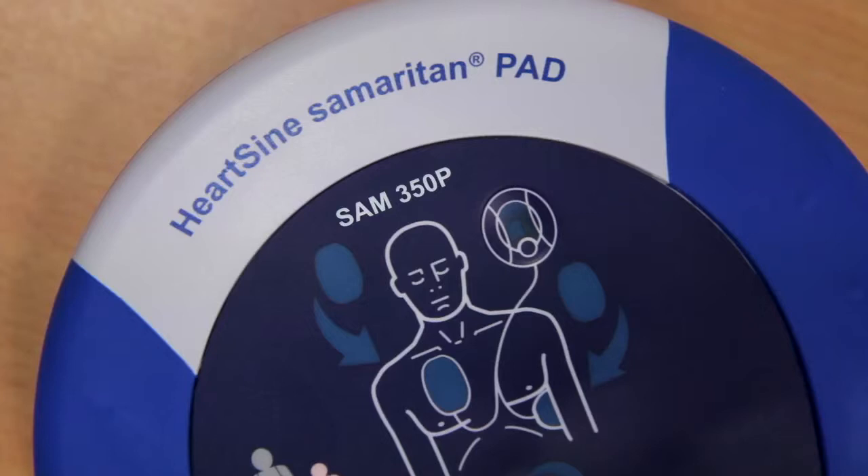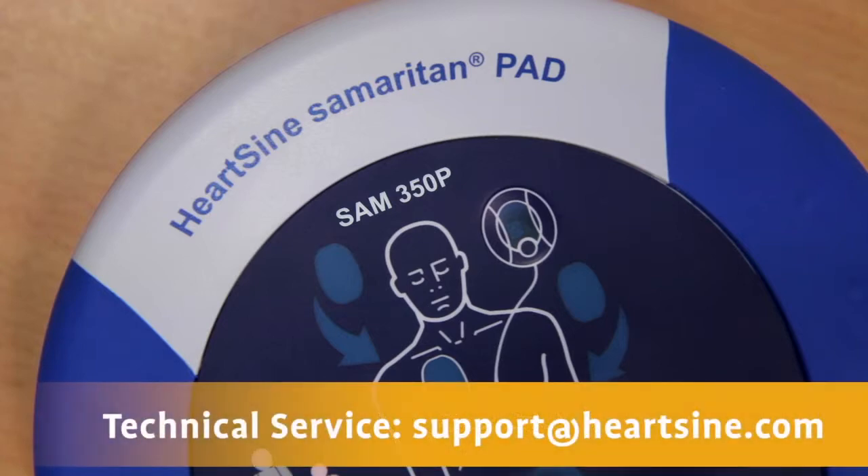If any issue is identified, the light will flash red. Also, an audible warning is made if the unit is turned off. If either of these occur, contact HeartSign Technical Service for assistance. The phone number can be found on the back of the user manual.